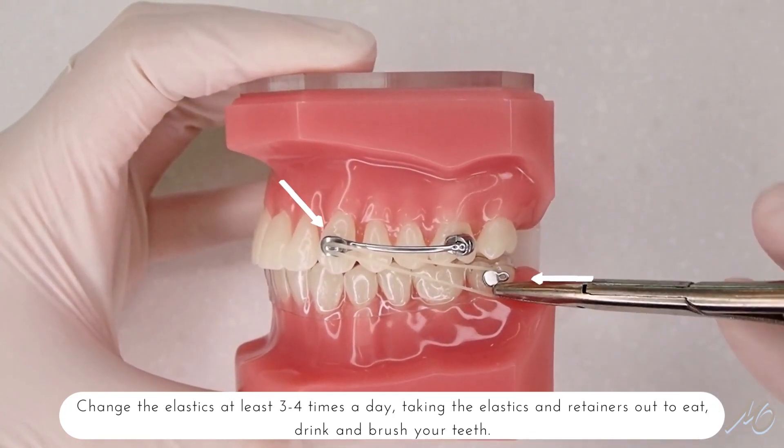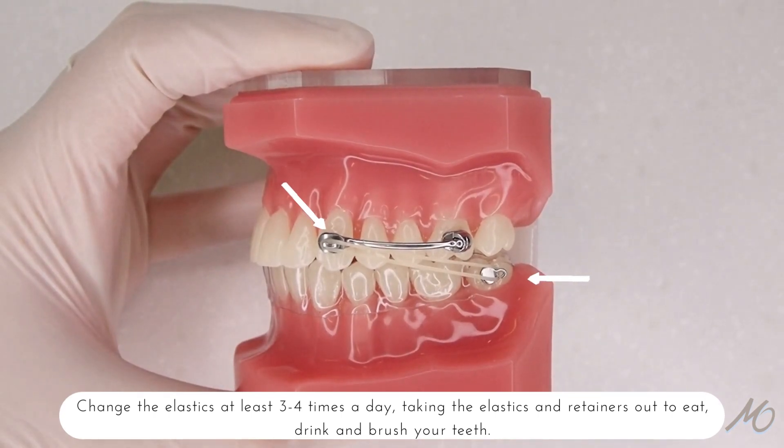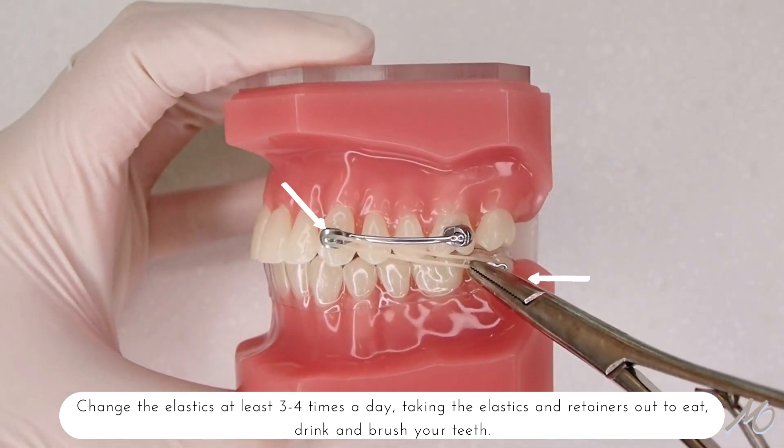Change the elastics at least three to four times a day, taking the elastics and retainers out to eat, drink, and brush your teeth.